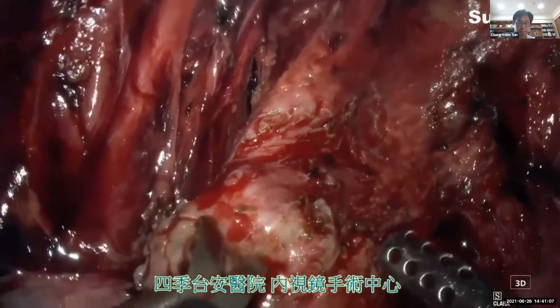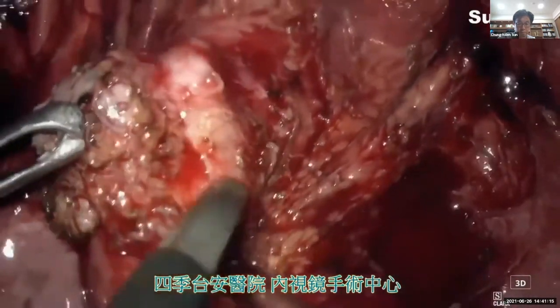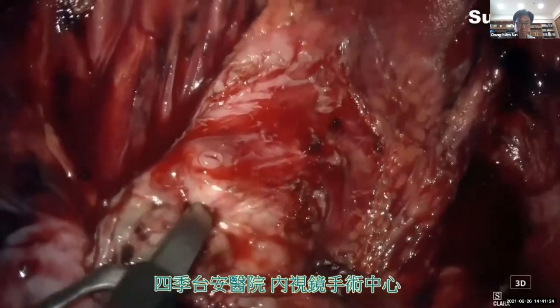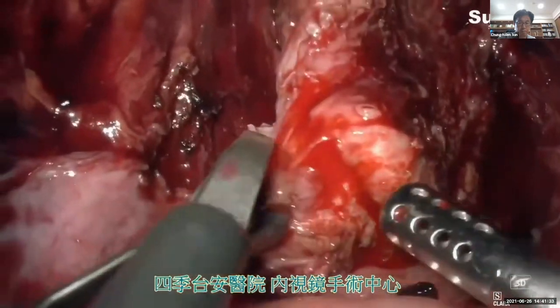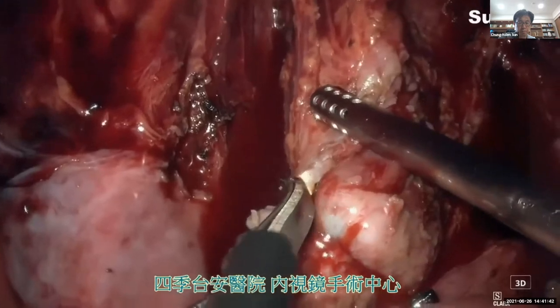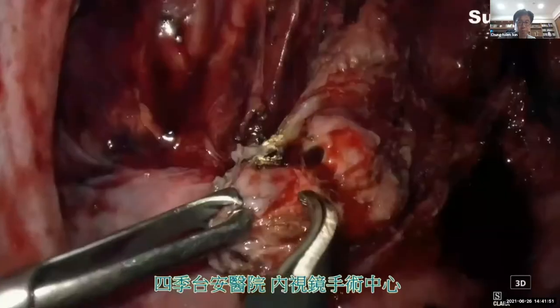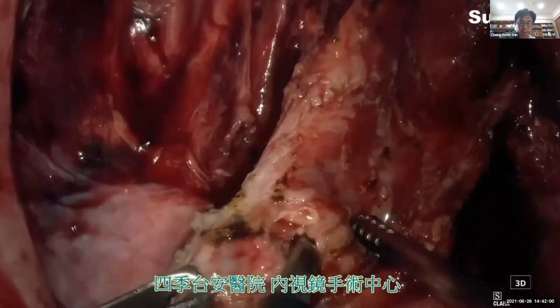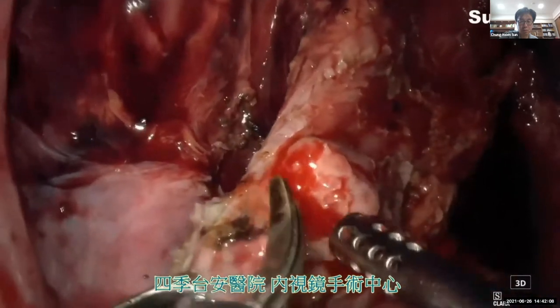With sharp scissors, cold cuts, and instrument palpation to feel if there is any residual DIE nodule. If the DIE lesions invade deeper into the inner circular muscle or even to the mucosa, we may need to get into the bowel lumen and transform our shaving into a disc excision.